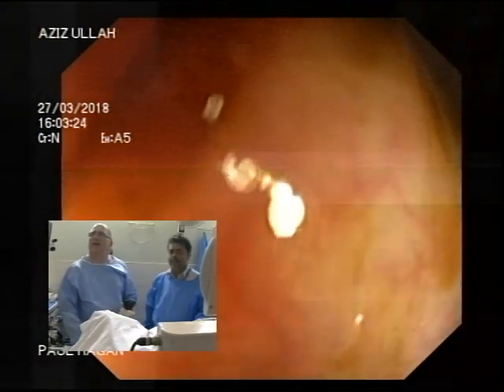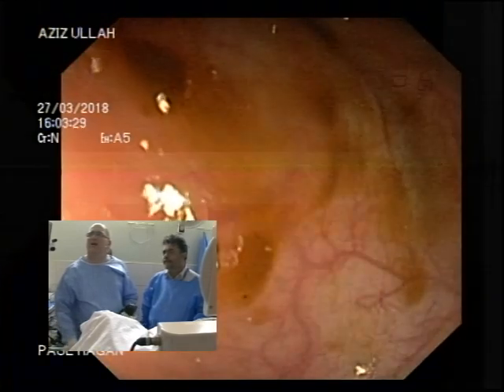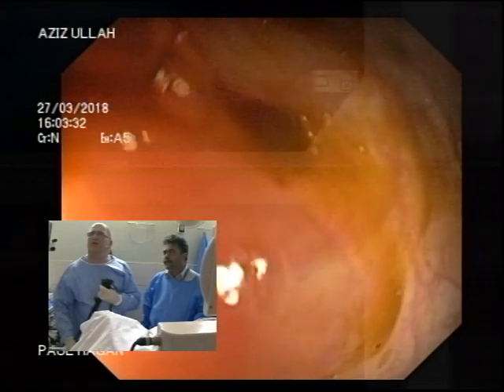Right. What's happening here is that the right side of the bowel, the transverse, is over-insufflated. Subconsciously, even though you've been very mindful about how much air you put in, you've shut off this flexure. So we have no option but to get the scope to want to go round. By getting it to the flexure, getting it to come back and applying the torque.